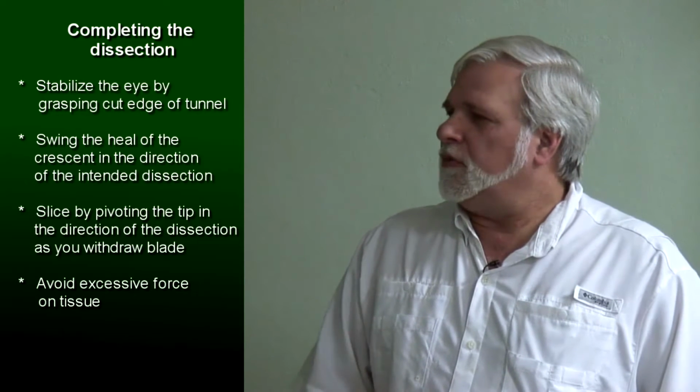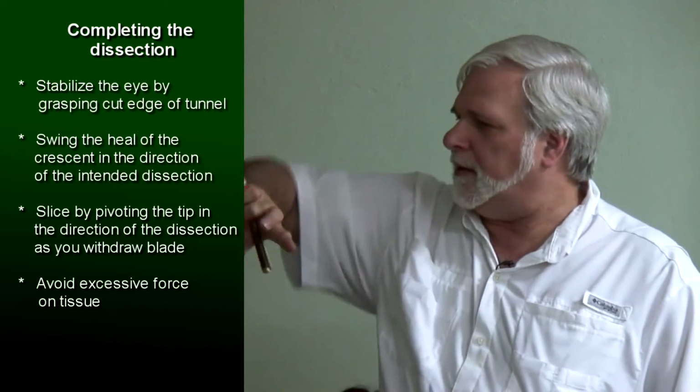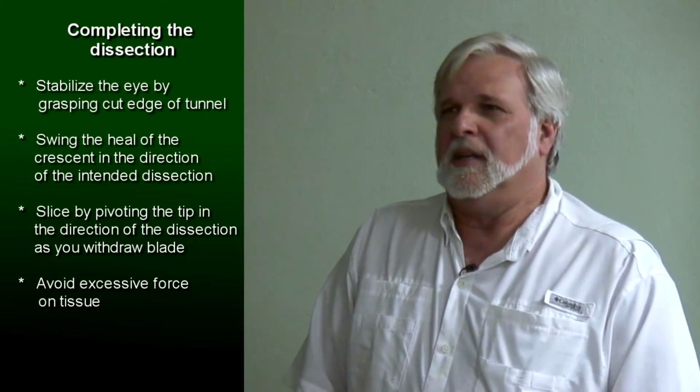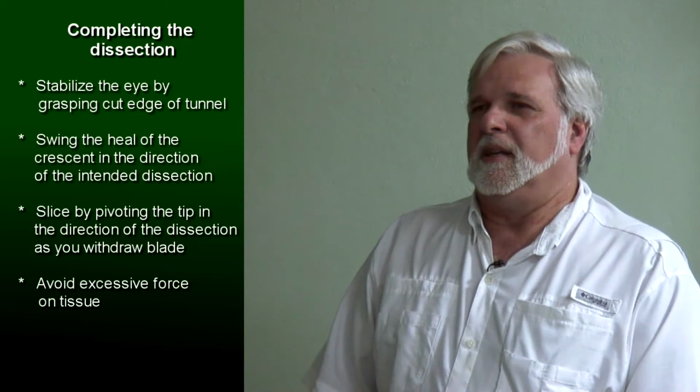A bridle suture won't do it. That won't help you at all with this. The eye will still roll around if you have a bridle suture in. I've watched that happen to a lot of people. So you need something good to hold on. I recommend holding onto the cut edge of the tunnel.